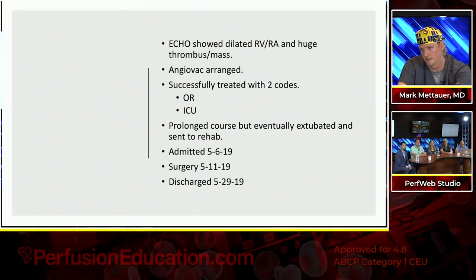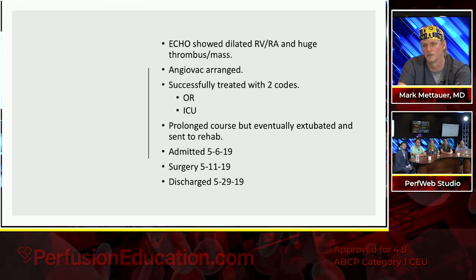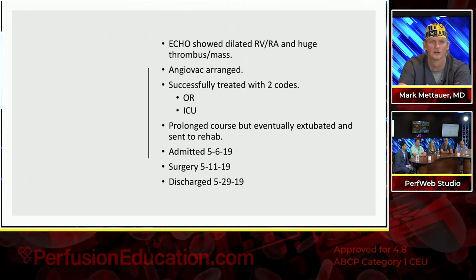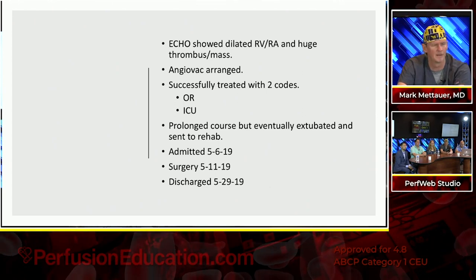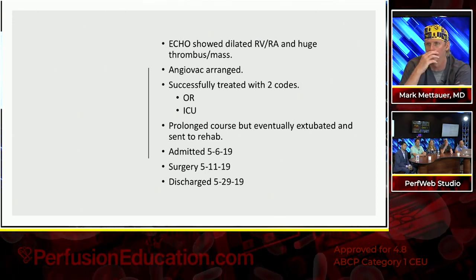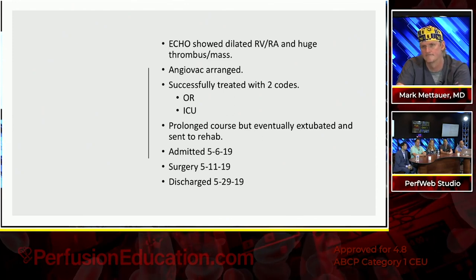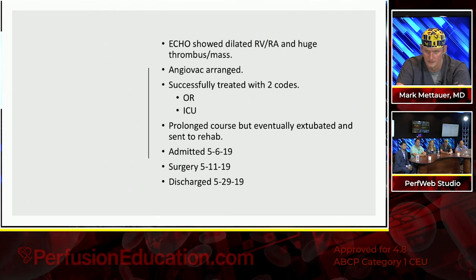we obtained the necessary instrumentation for an AngioVac case. And this was done in another hospital where we don't have it ready to go and available. So we actually had to wait about 36 hours, I think, to get it set up. She was stable through that, other than requiring a little bit of high FiO2 and pretty aggressive fluid resuscitation and anticoagulation. Yeah, we did it on Saturday.